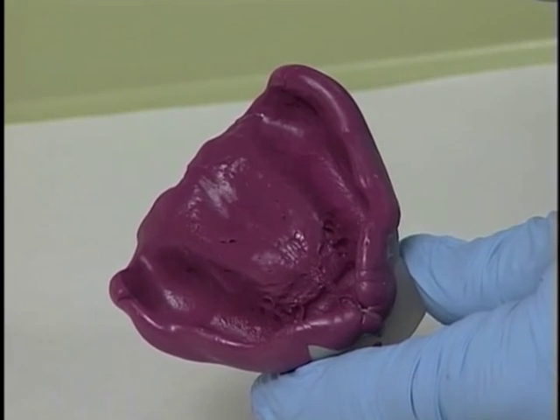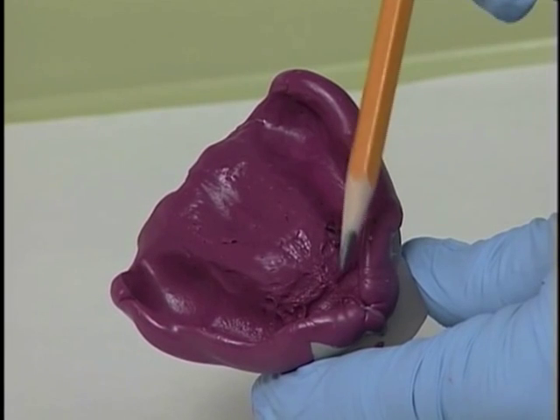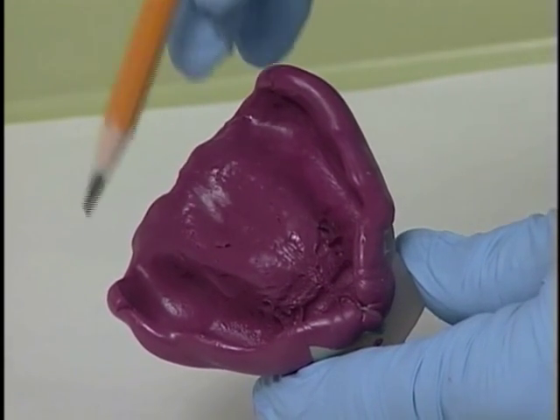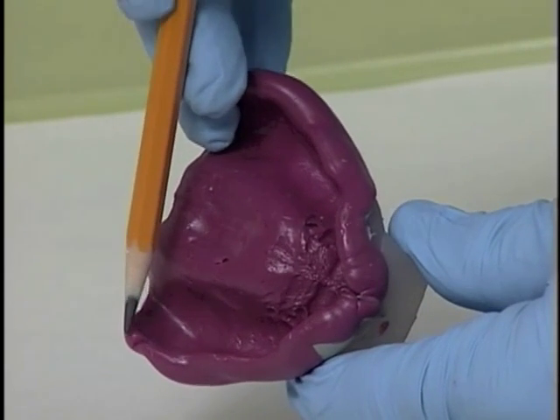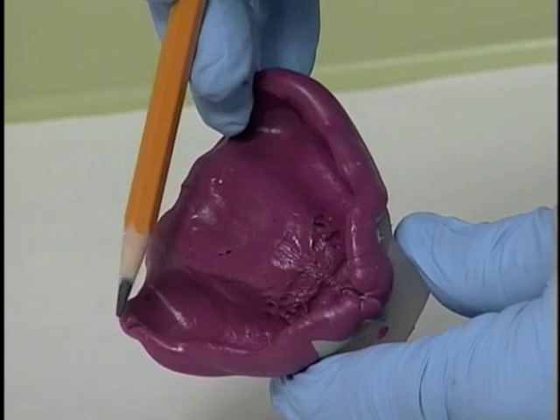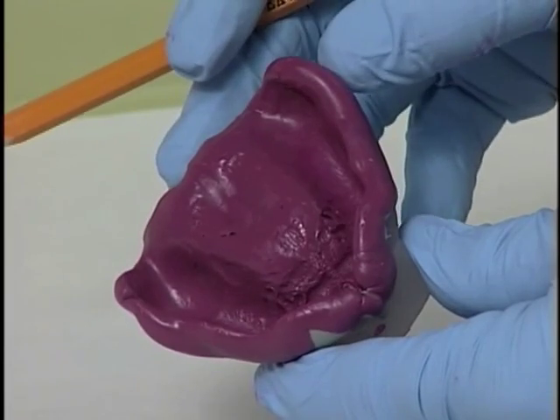We can see we have an excellent impression in that we have nice rolls on the peripheries. They all look very nice and rounded. There are no problems with the peripheries except a very small little bubble right there on the right distal buccal space. That's so small I would not redo the impression for that.